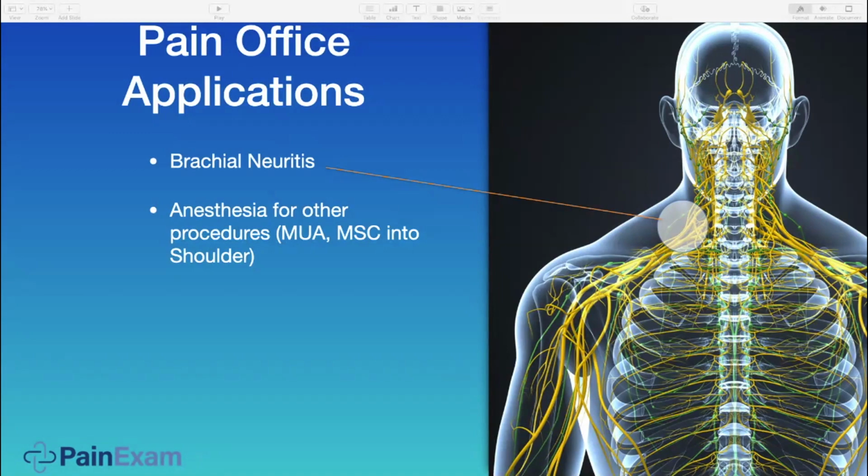When you're doing a biologic procedure, for instance, a bone marrow aspirate mesenchymal stem cell procedure or a PRP procedure, you don't want your local anesthetic to mix with the biologic that you're injecting, because with PRP, for instance, there can be an impairment of platelet function with the local anesthetic. So it may be desirable to do a nerve block more proximal, like an interscalene nerve block, to anesthetize the patient when you're doing the procedure. The CPT code for this is 64415.